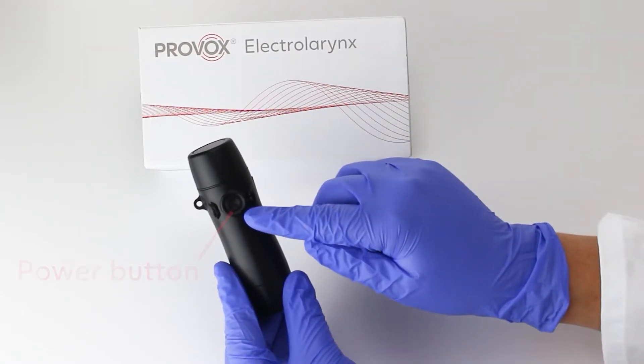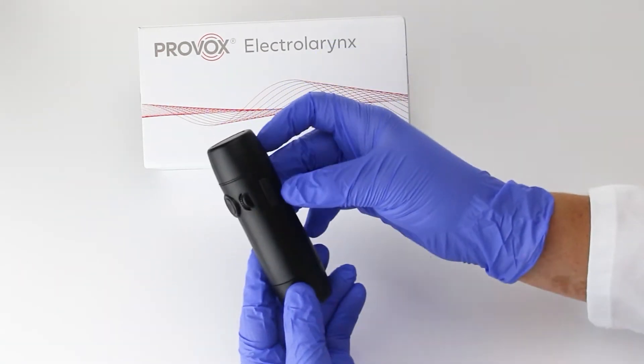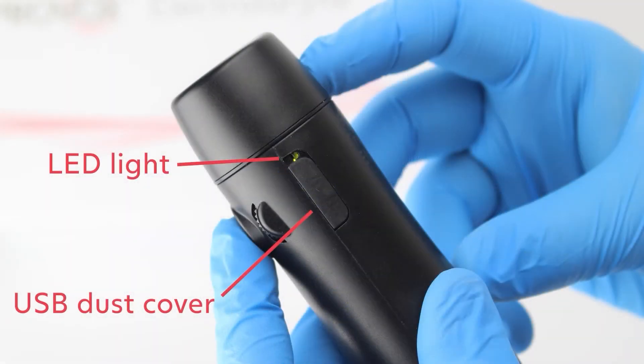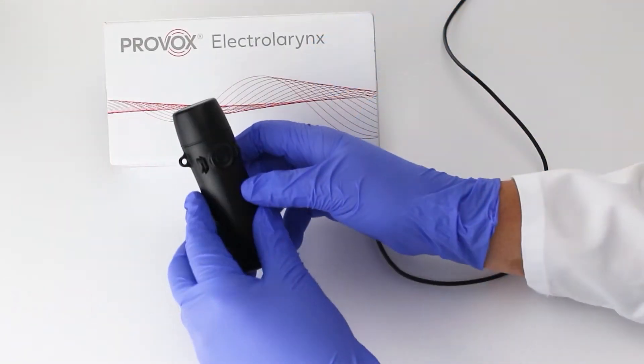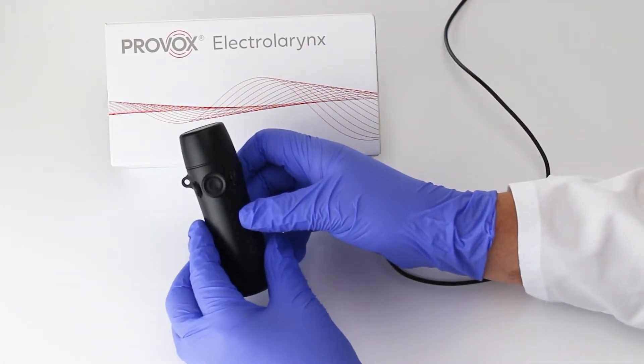To check if the battery is low, press and hold the power button. If the LED light above the USB dust cover illuminates, the device's battery life is at 20% or lower. Once you've identified the device has a low battery, it will need to be charged in order to restore full volume.